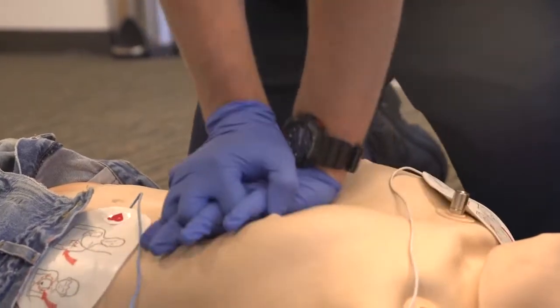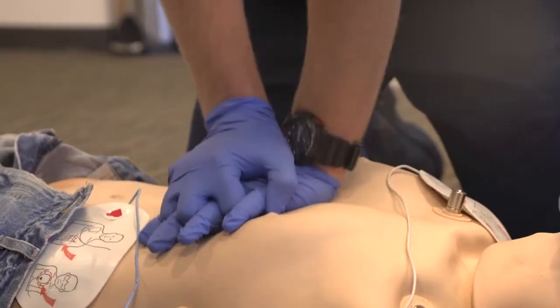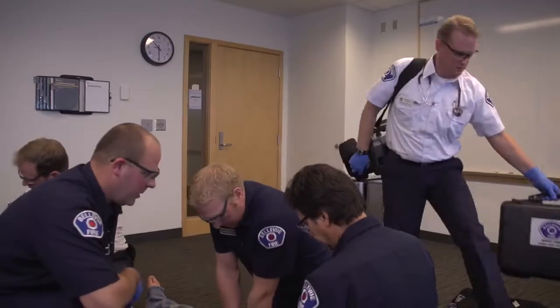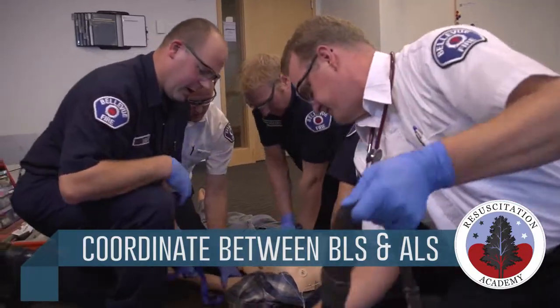26, 27, 28, 29, 30. 20, just ventilations. Matt, how's it going? Good. 28, 29, 30. One more respiration round. Good ventilation. We're going to swap out so we can analyze it.